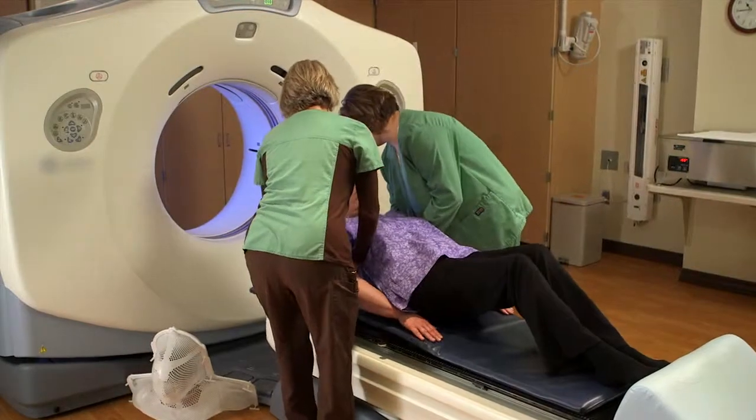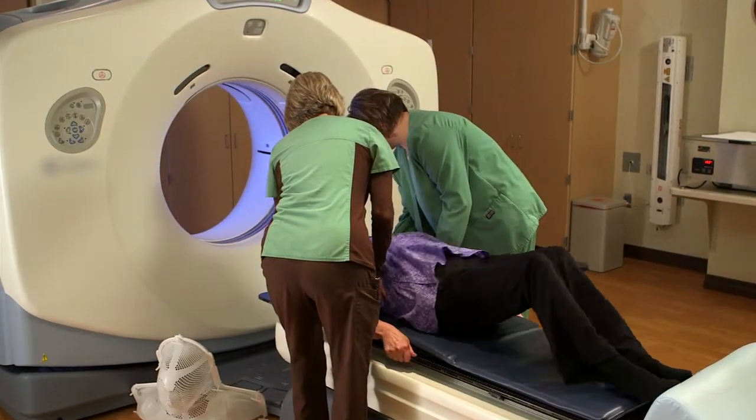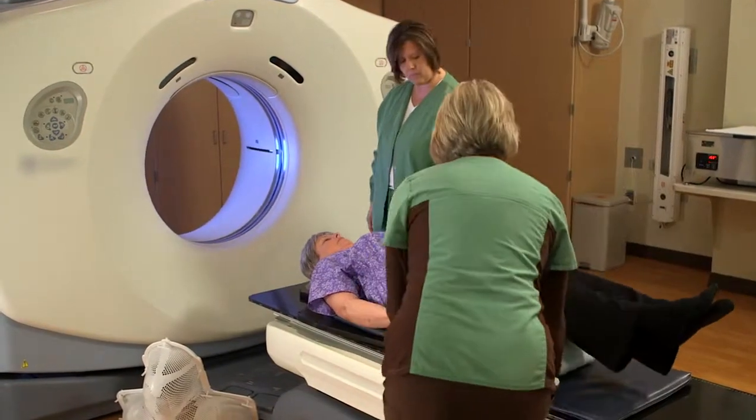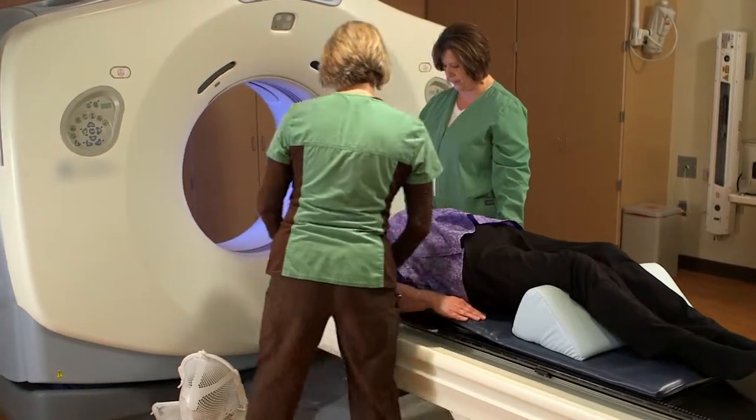That information then gets transferred to the treatment planning computer, and that's where we go to work to design the radiation fields. In this step, called CT simulation, you are positioned exactly as you will be for your radiation treatment. Special immobilization devices support you to help you stay as comfortably still as possible.